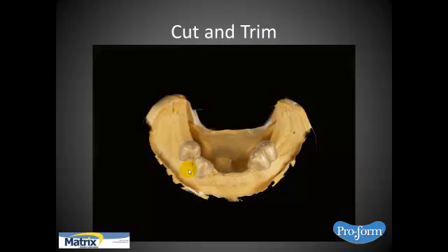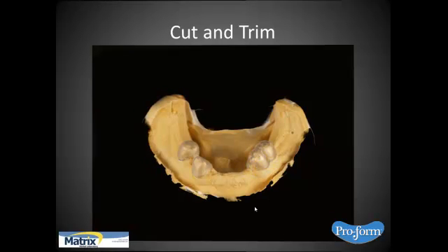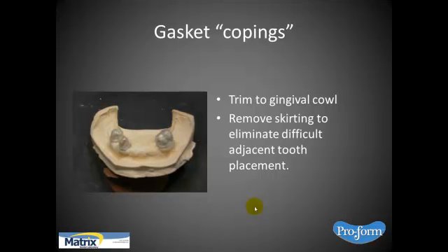Once it's cooled and you've taken it off the model, you'll cut and trim away from the sheet of material — you're going to have a junction. Come to the base of the model at the bottom. You don't want it to be short, because you don't want hard acrylic to run up underneath and lock in an undercut. Trim to the gingival cowl and remove the skirting to eliminate difficult adjacent tooth placement. If the material spreads out like a skirt, that's going to get in the way of setting a tooth. Make sure it comes to a junction at the cowl and is well adapted.